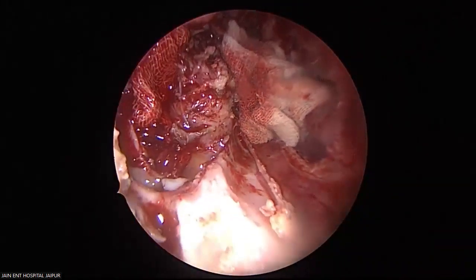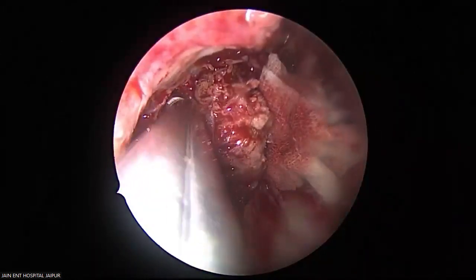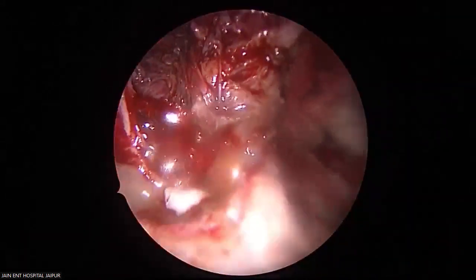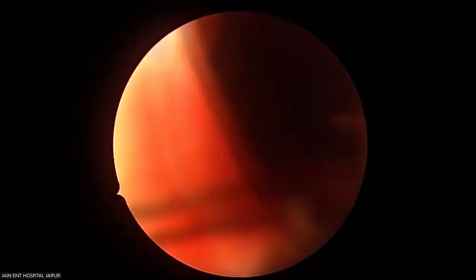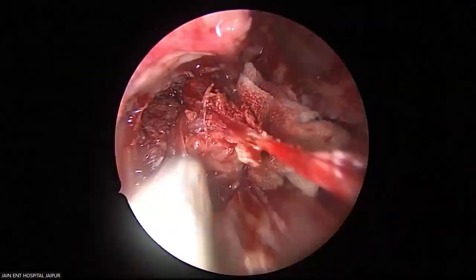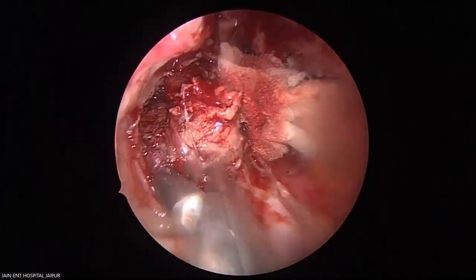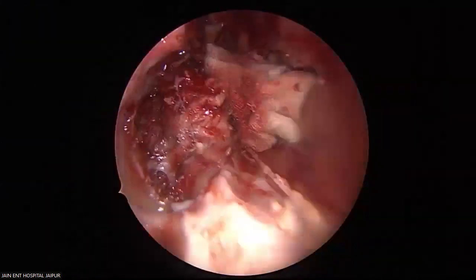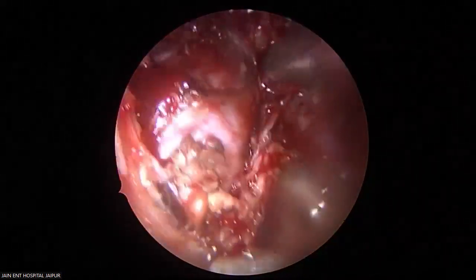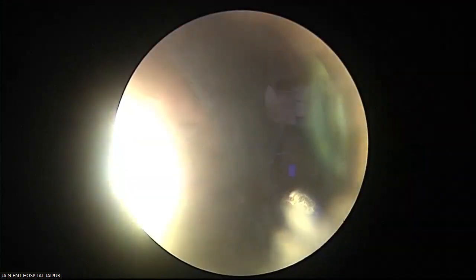Now, coming to the lateral part. We took the advantage of this exposure and felt the various parts of the tumor in front of us. See this? I told you, removal of the lateral part with this exposure is much, much easier than removal of the medial part. Yes, yes. You have to hold it, advance your hold, keep bringing this tumor out and keep using your coblator on the interface. See, one of the big vessels. Yeah. See now?